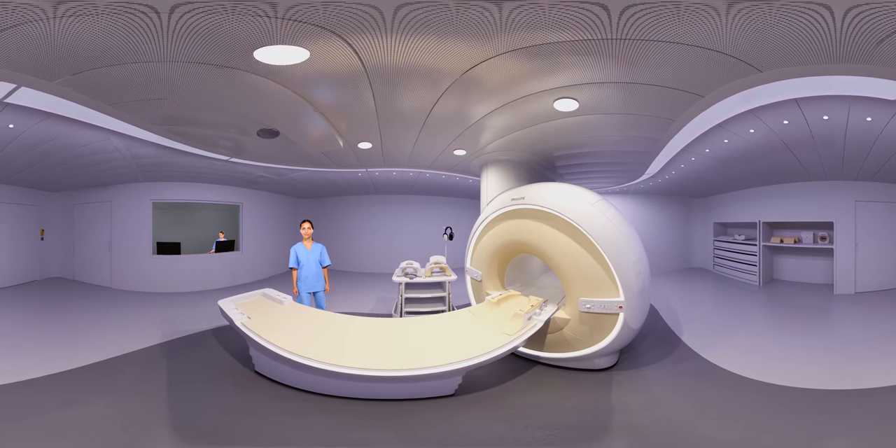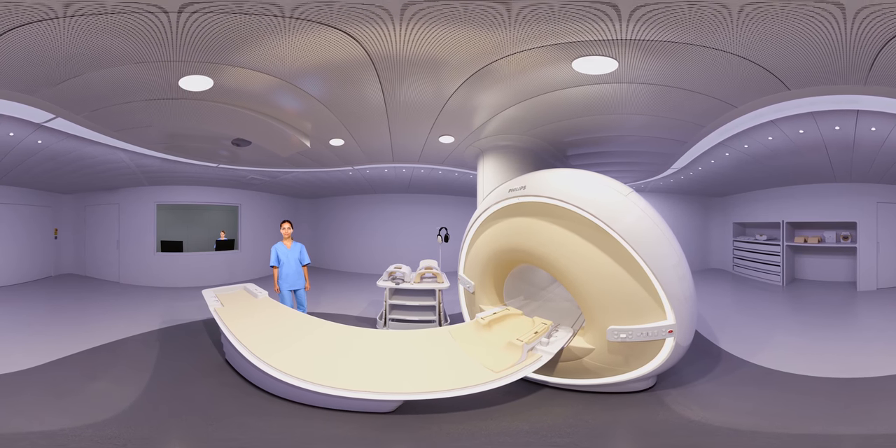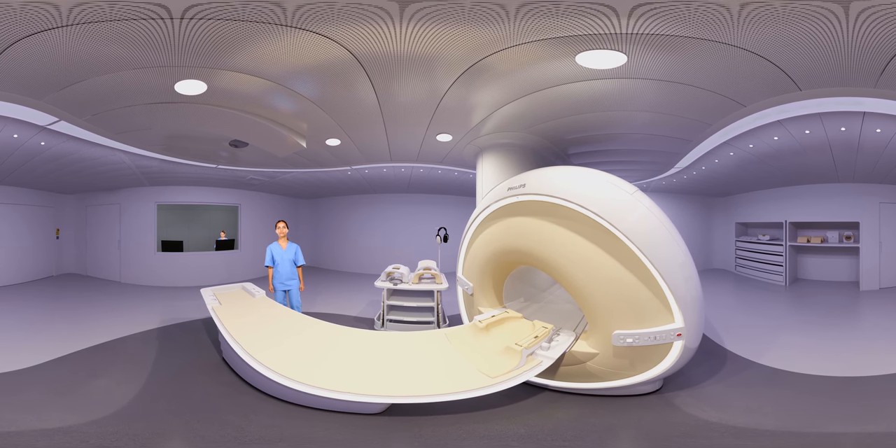Look at the cart behind the table. You will see earplugs and headphones that play music to block out the sound. There is also a button that you can use to get the attention of the operator at any time. In between scans, you can even talk to them, but this will be more difficult during the scans because of the loud noises.